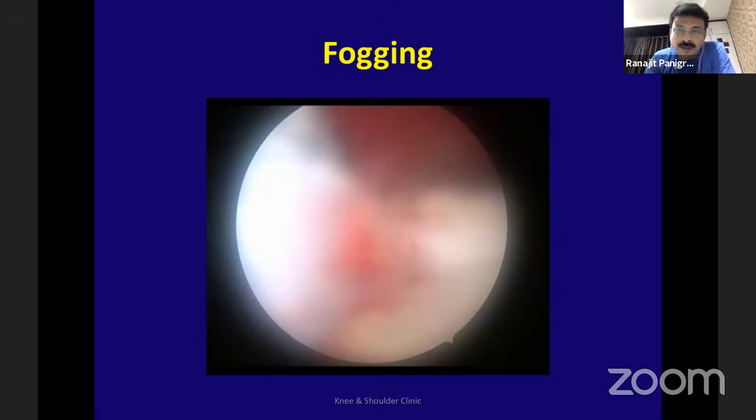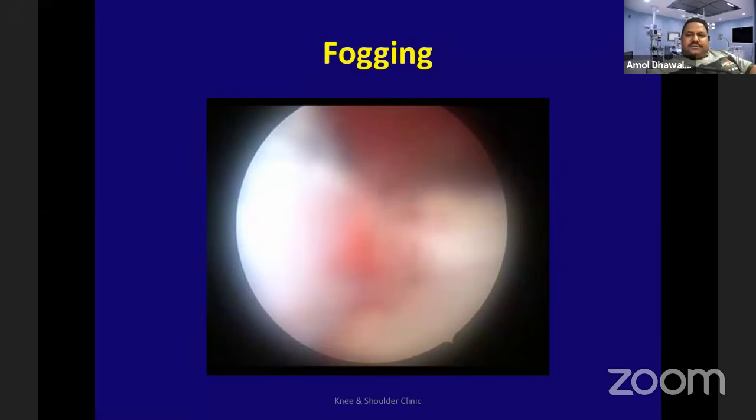Sir, about tourniquet, what is the threshold of any thigh circumference or weight beyond which you don't apply a tourniquet, or what is your criteria regarding applying it, or every case you apply? I think for beginners, I would advise use a tourniquet always. Nothing. If you have a good enough tourniquet and a fat patient and your tourniquet is a good size, you use it. If your tourniquet is not fitting the patient, of course you can't use it.